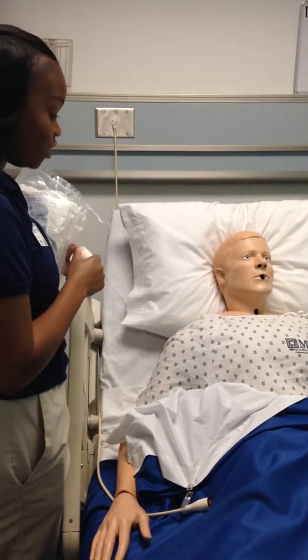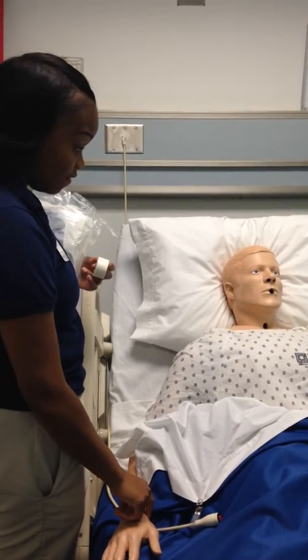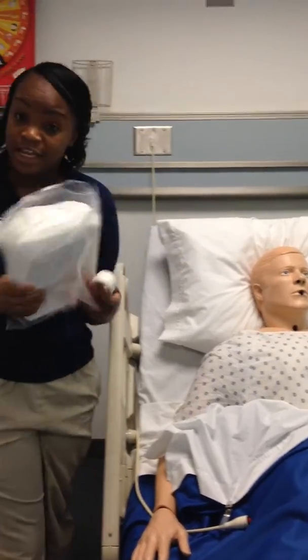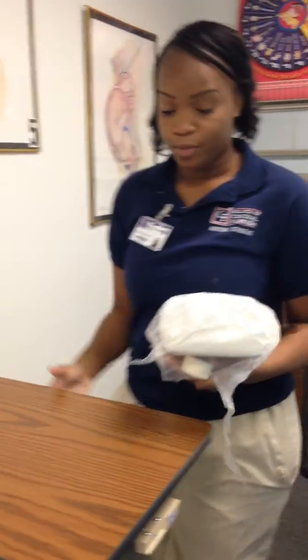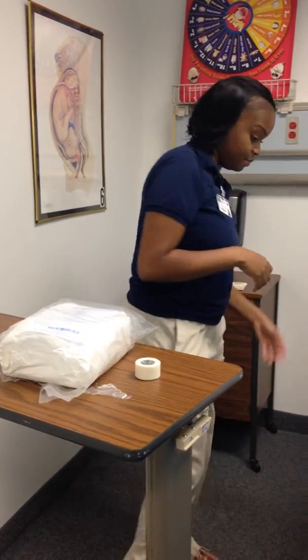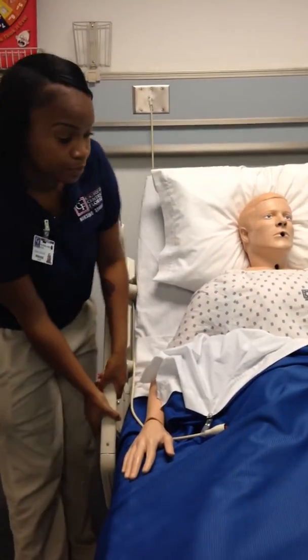Yes. Okay, great. I'm going to ask you a question. Are you allergic to any iodine, or do you have any allergies to shellfish or any medications? No. Okay. I'm going to go ahead and get started. I'll wash my hands again. I'll make sure that the table is clean. I have tape, and I brought an extra pair of sterile gloves just in case I need them. I'm going to go ahead and place the bed up to working level.